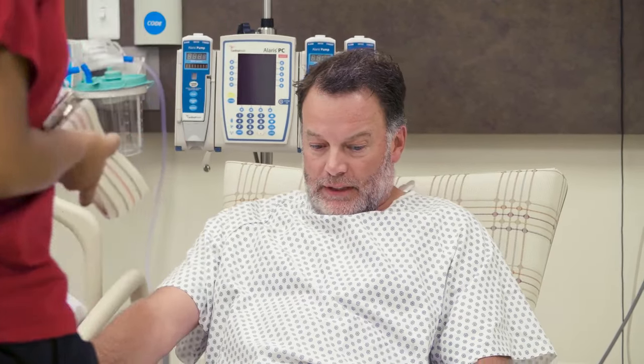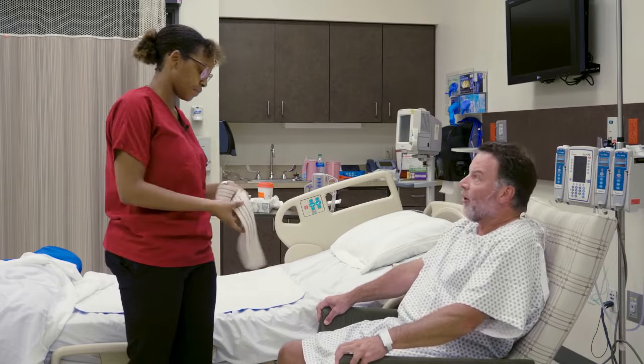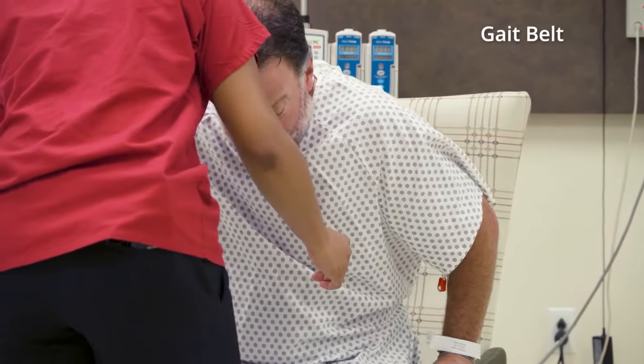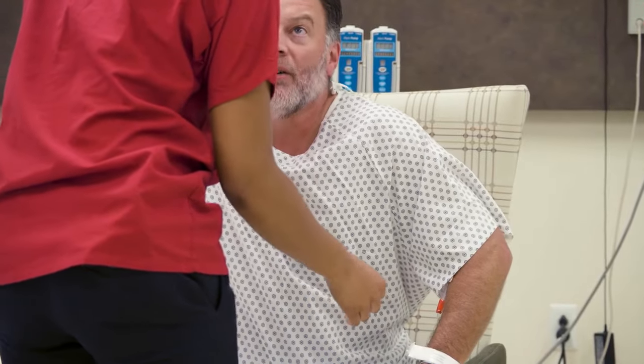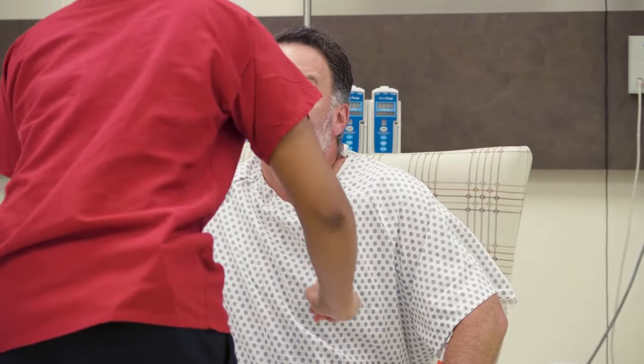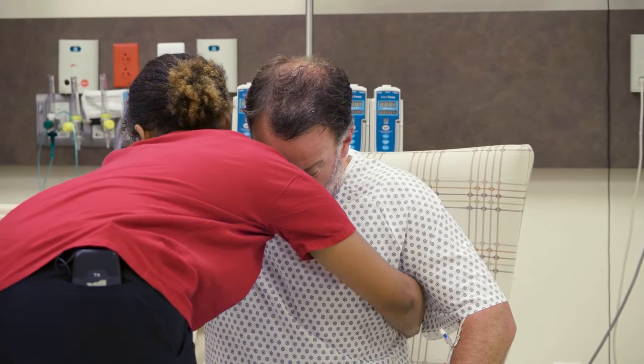Are you ready to get back to bed? Definitely! A transfer or gait belt is used to help nursing staff support a person who is unsteady or weak. This time is different than the way you got up before, so I'm going to place this belt around your waist.